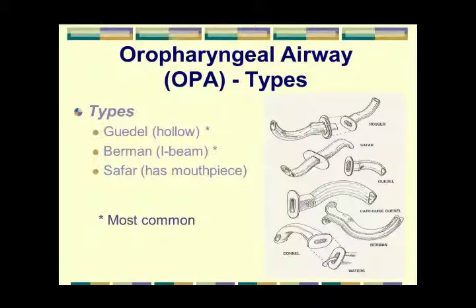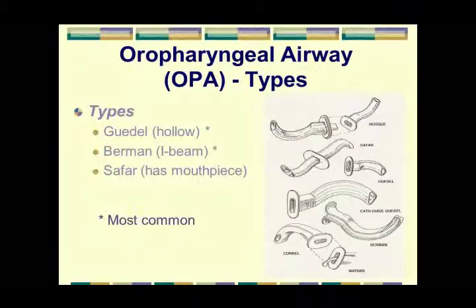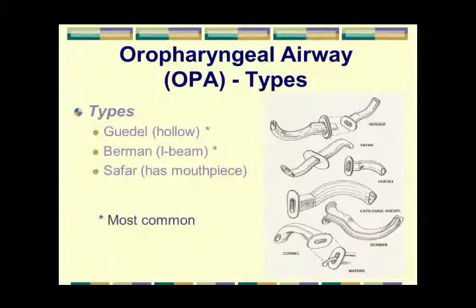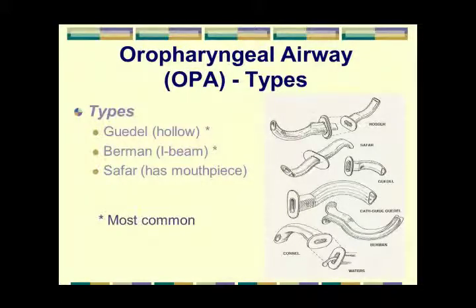Okay? It's not designed for that. It's designed for airflow to go through. Okay? There's also one that has two mouthpieces so you can blow through one. Yeah, that's gonna happen. In life, I think I've said this before, there's only one thing worse than doing mouth to mouth. Mouth to stoma.